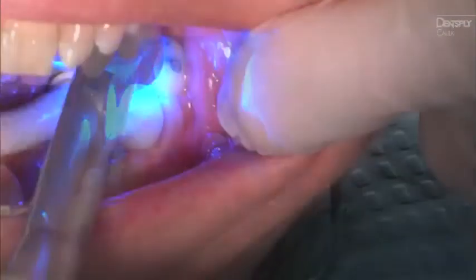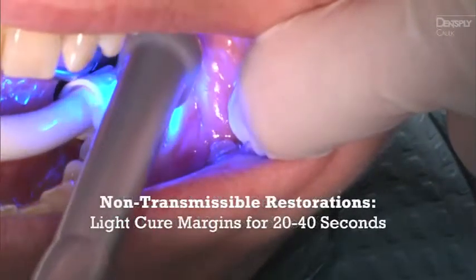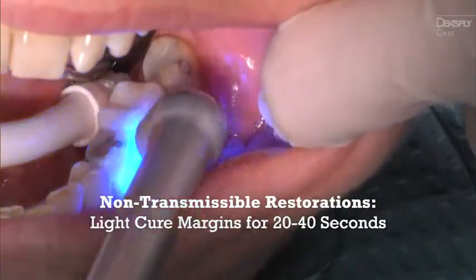lingual, and occlusal surfaces for 10 seconds on transmissible restorations. For non-transmissible restorations, light cure exposed margins for 20 to 40 seconds to assist restoration stabilization.